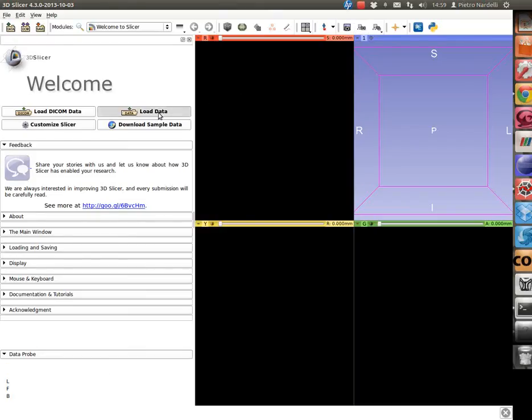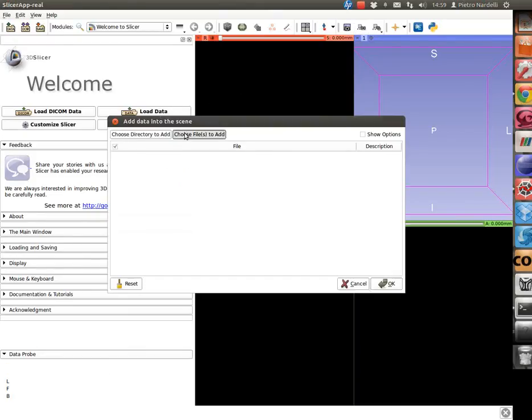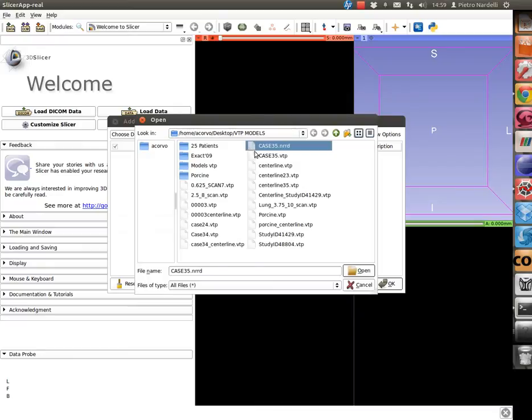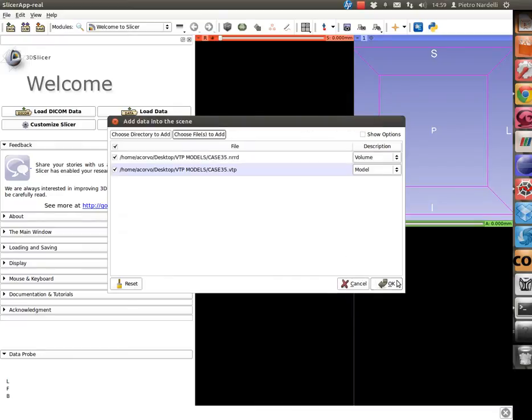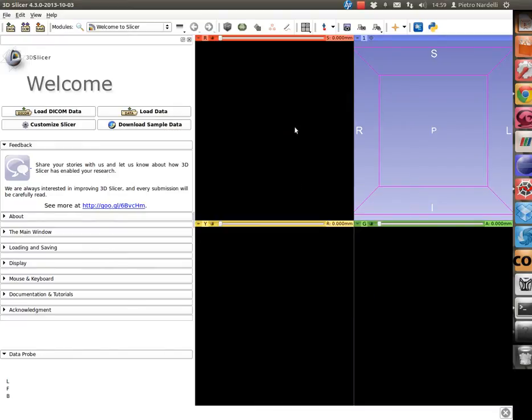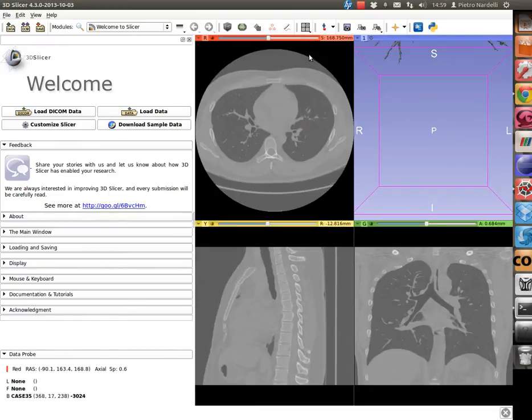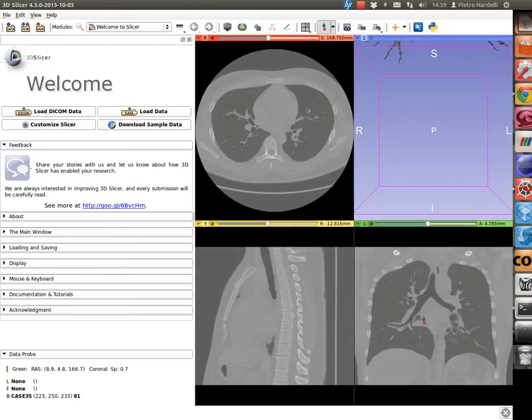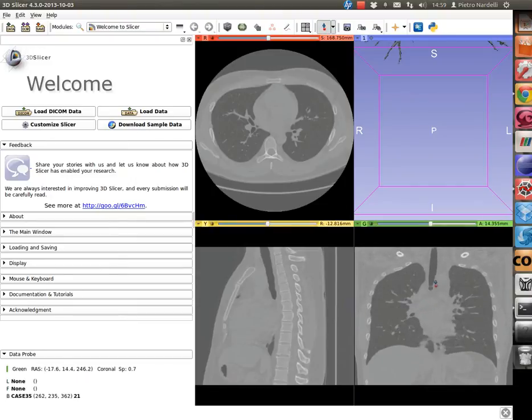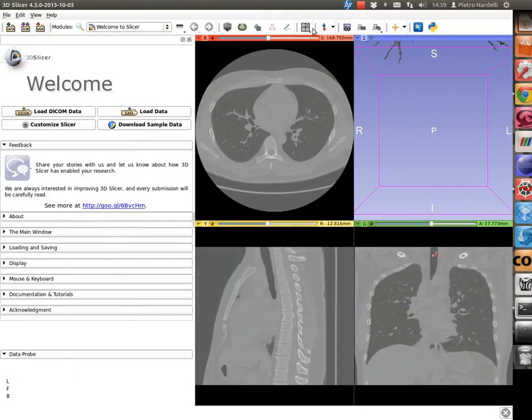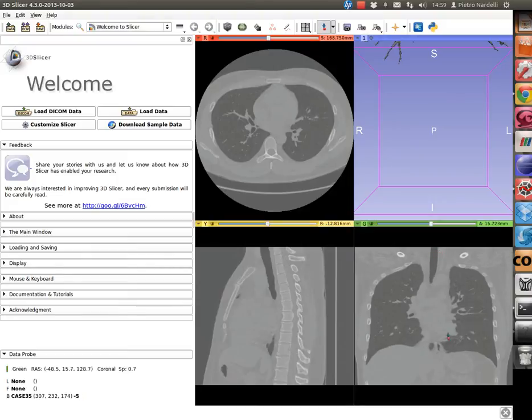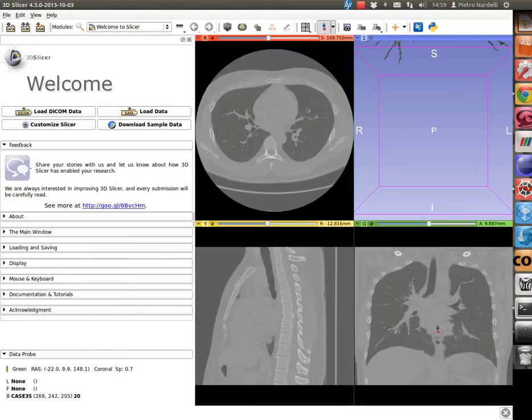As a first step, a 3D model of the airway and the corresponding chest CT image have to be loaded into slicer. Then, two fiducial points have to be placed in the chest CT image. The first one will be used as a starting point and can be placed, for example, inside the trachea.